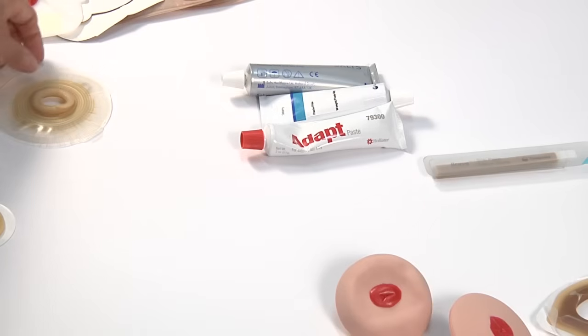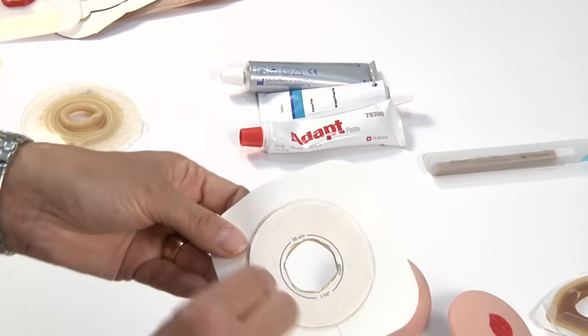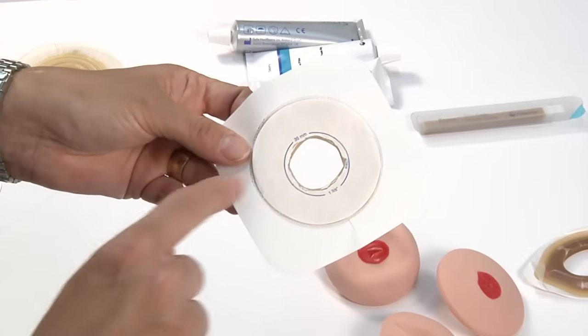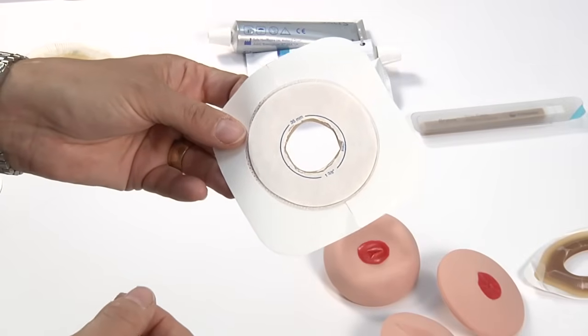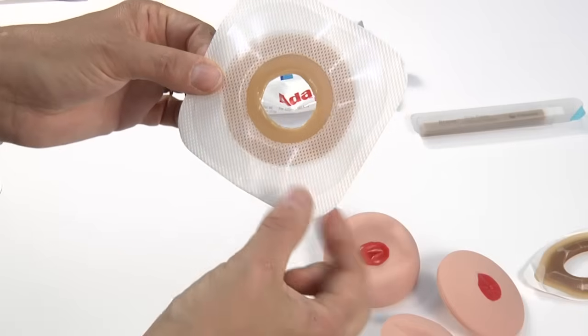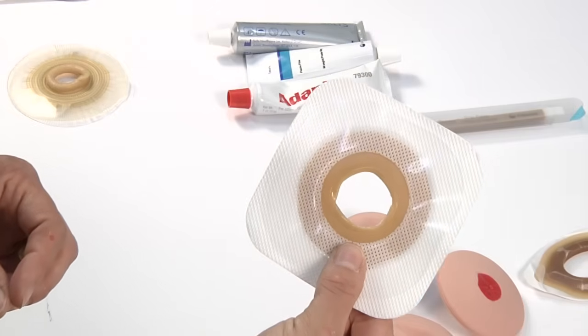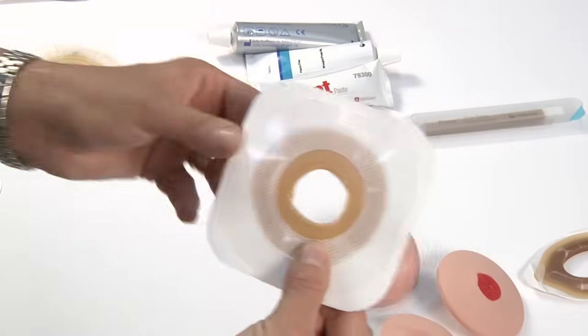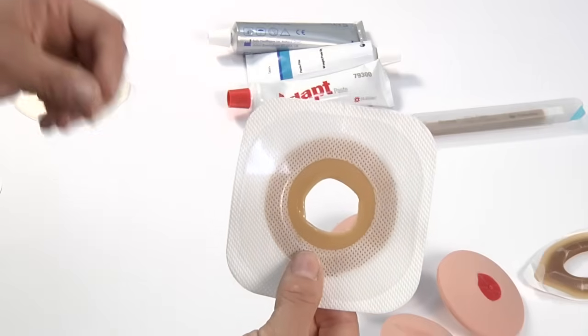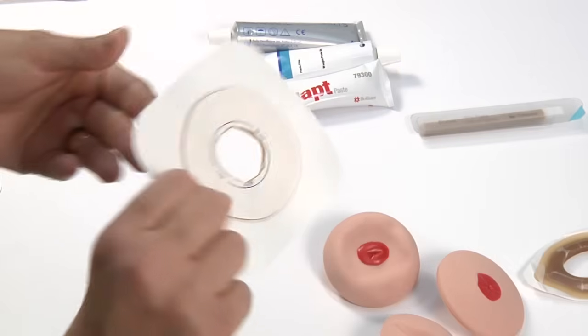When you're typically using a paste, you want to make sure that there's a good bead. We're using this usually to fill in the gap with the traditional barriers. When you size the barrier opening, it's usually about 1/8 of an inch or 3 or 4 millimeters larger than the base of the stoma itself. And for that exposed skin, we're typically wanting to protect that with some sort of a barrier accessory.